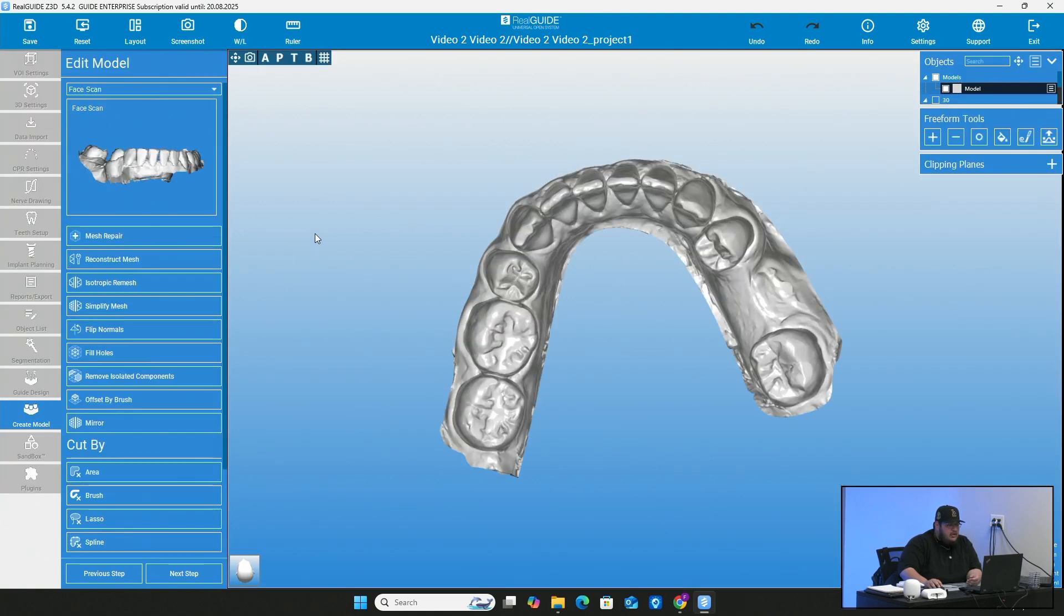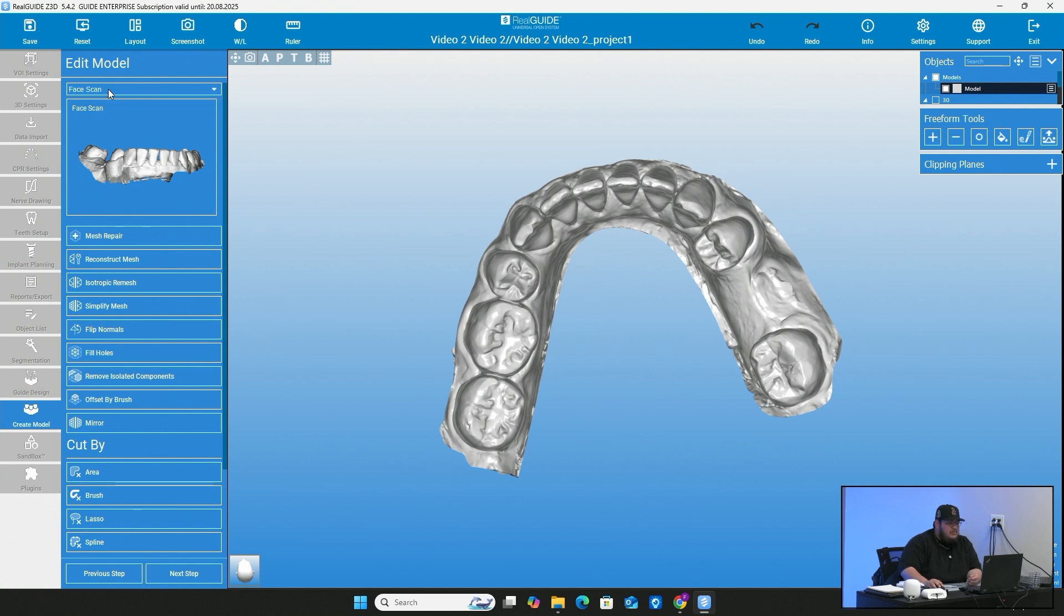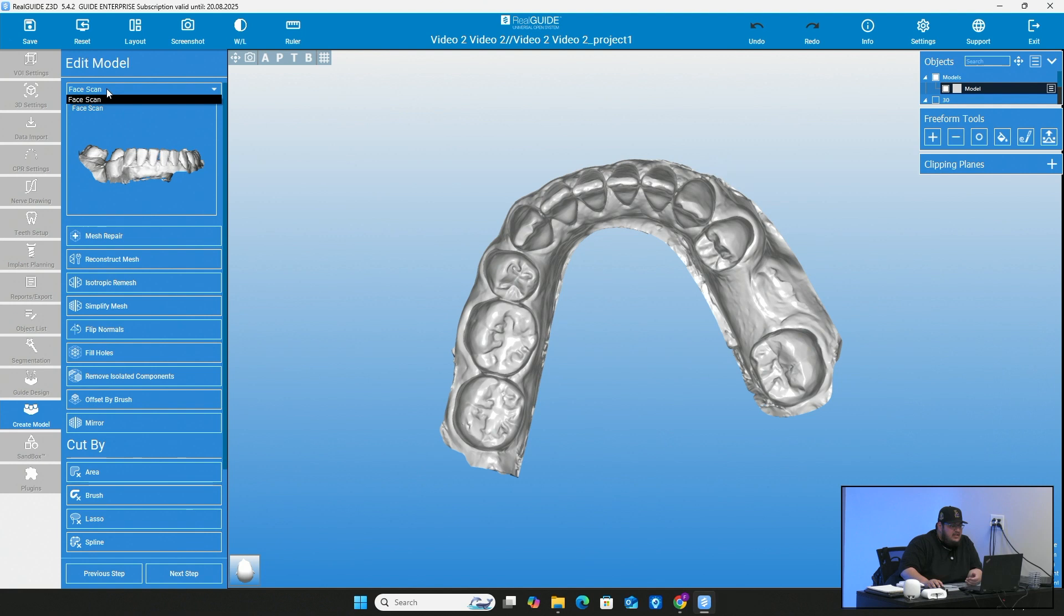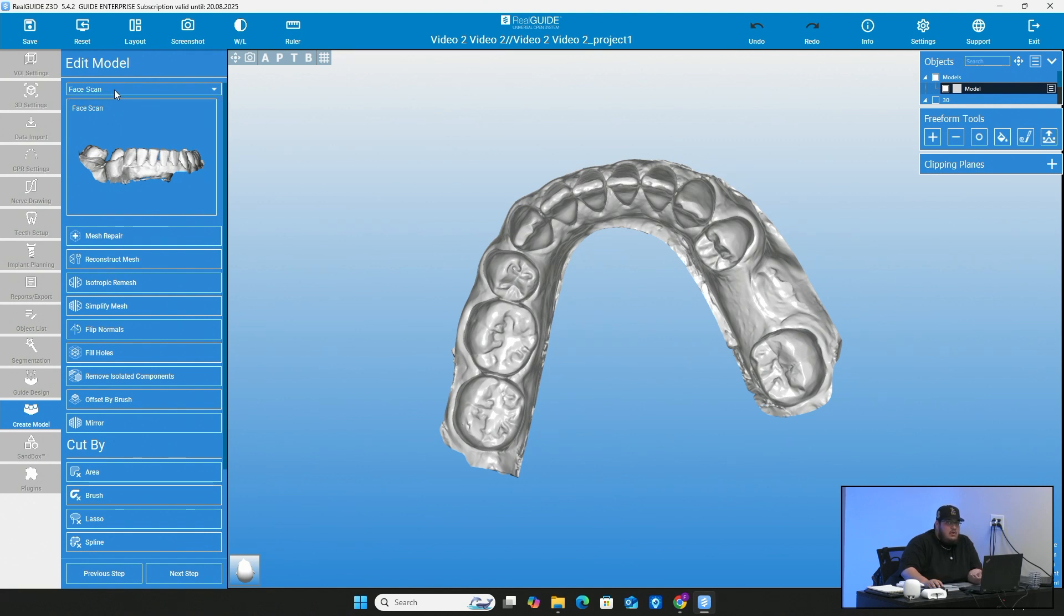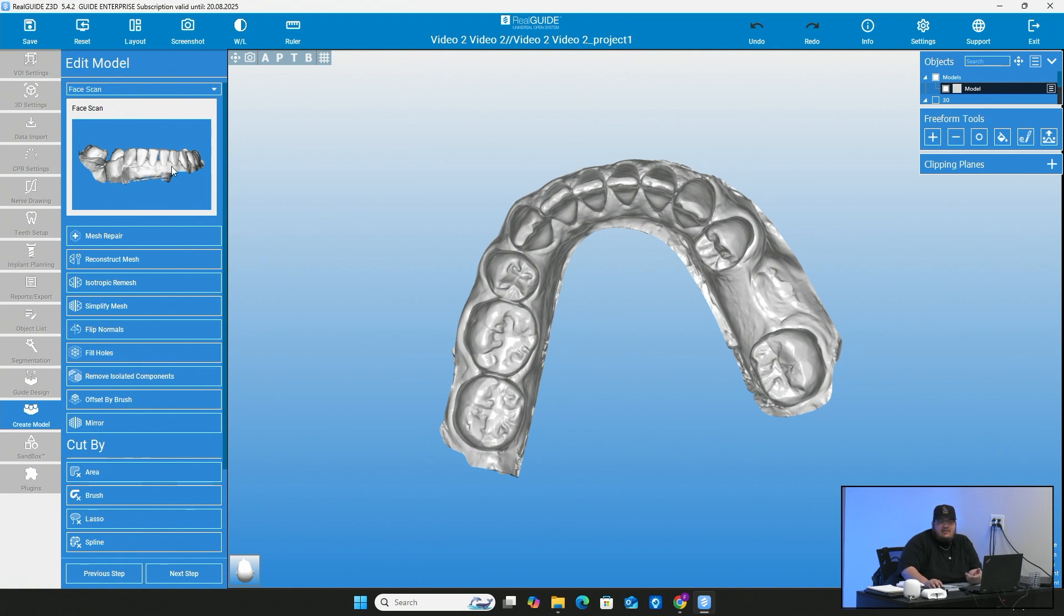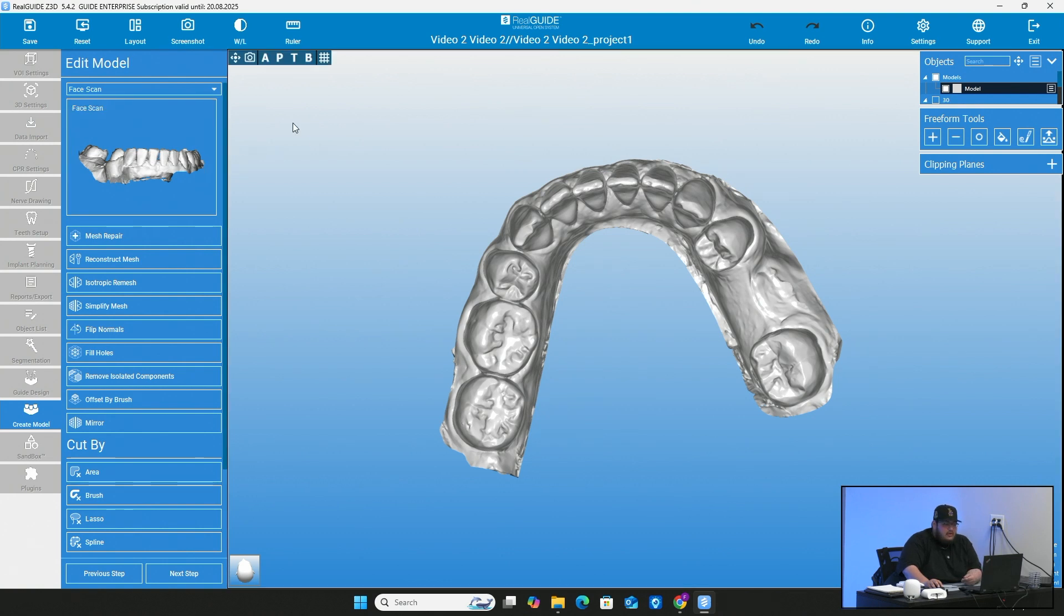Once you've clicked on create model, on the top you can go ahead and choose what object it is that you're going to want to use. So for us, we only have one scan in here. But if you bring in multiple scans, like one with a wax up tooth on it, maybe one before extraction or anything like that, you can differentiate which model it is or which scan you want to use to make this model. So just make sure that you have the right one selected.